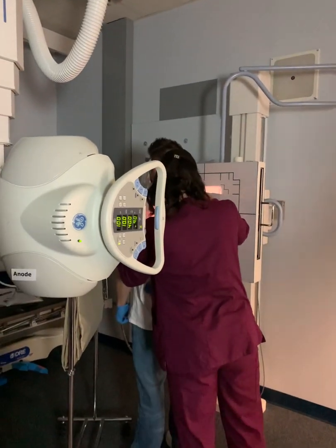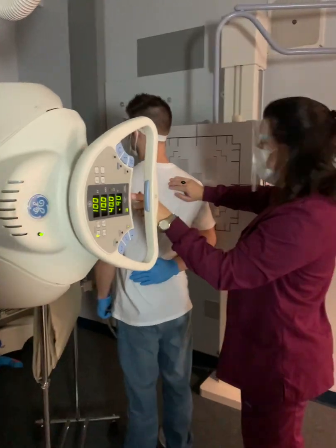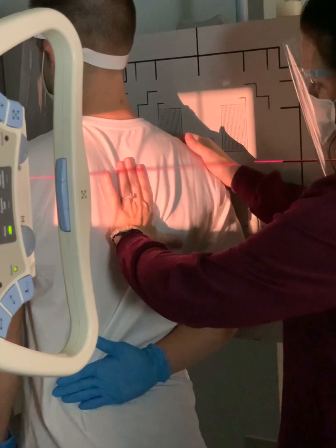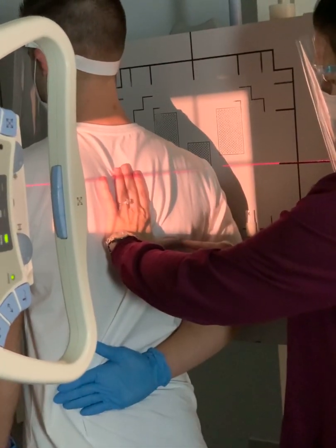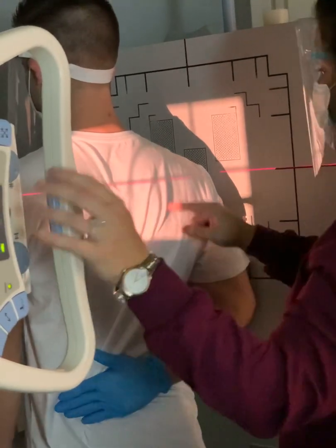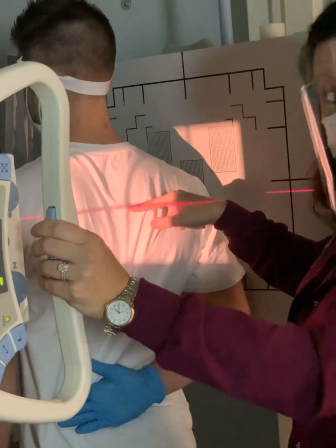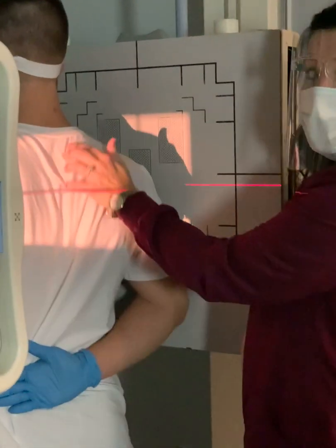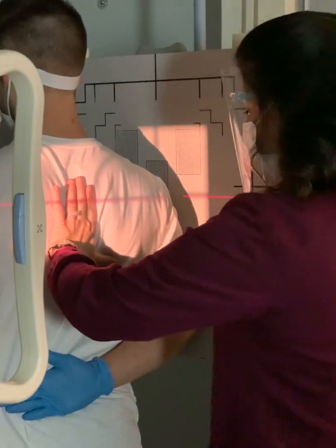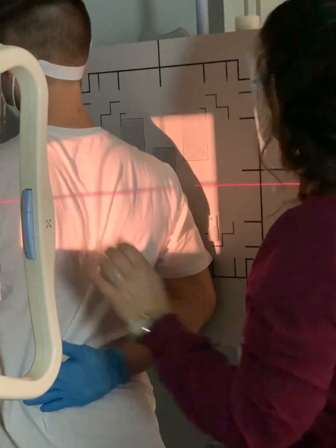Just about perfect there. And then here, see the border of the scapula there? I can take my hand and kind of do like this. My thumb is going to be the inferior angle of the scapula down here. Okay? So I have to come down, and I'm coming through the middle of the medial border. This is the medial border of his scapula, what's closest to the spine, right? So make sure you've got inferior angle included.